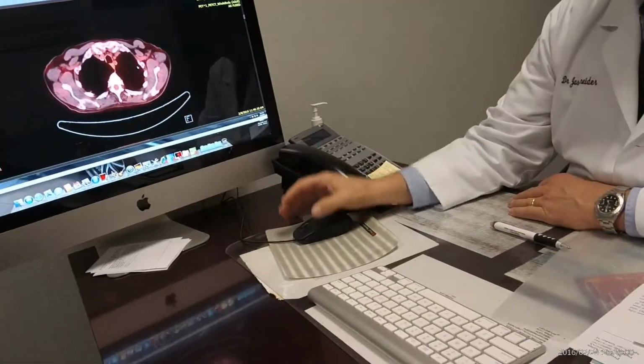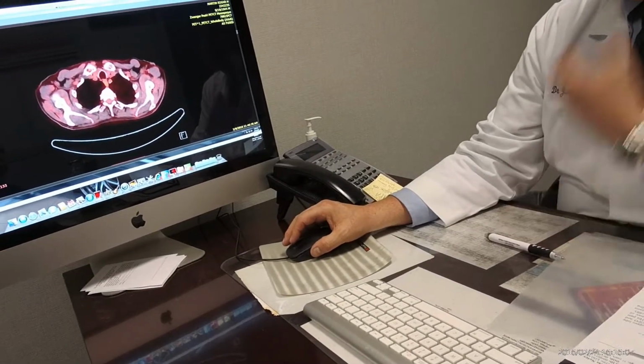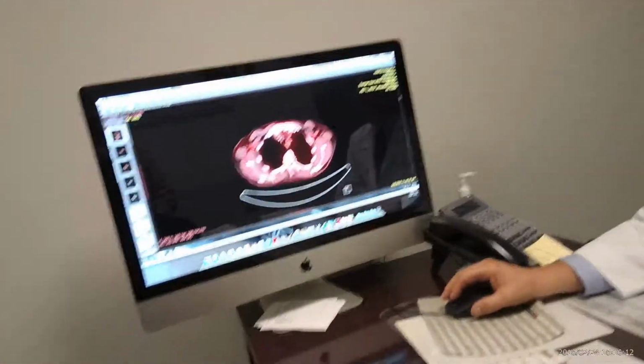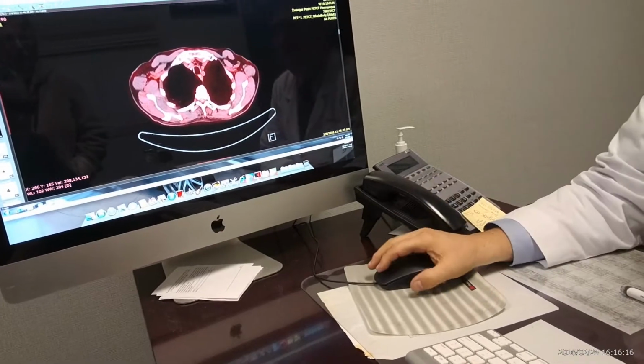And every time I click this, we're coming 5 millimeters lower down the body, from the head all the way down. What we are looking at here, for example, are the heads of the clavicles, the collarbones. Right about here, you start to see the sternal body, which is the breastplate right here. So it tells you about where we are in the chest.